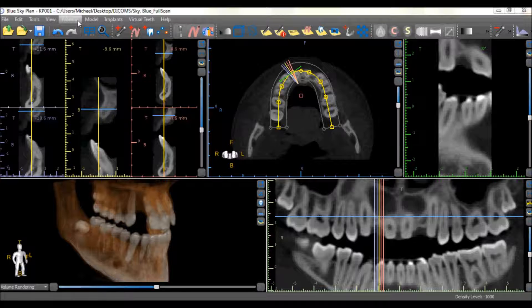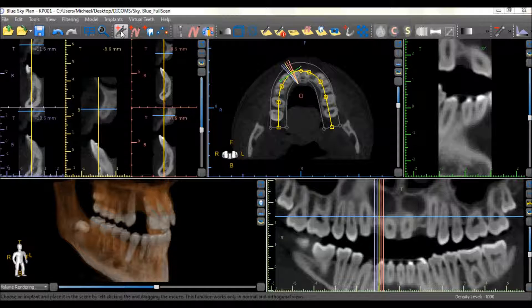An implant can be added in any of the 2D or 3D views. It is recommended to identify the desired location and the relevant view before placing the implant. To place the implant, select the Add Implant icon in the horizontal toolbar.